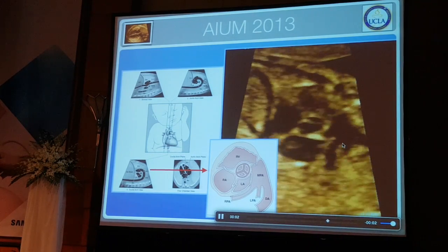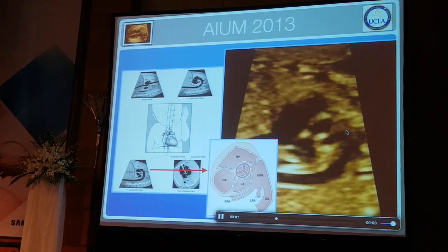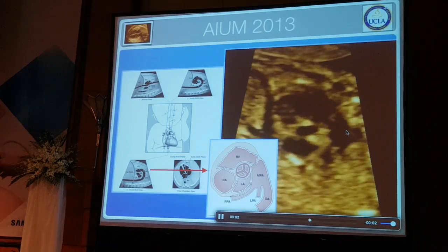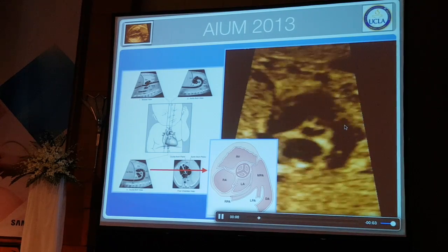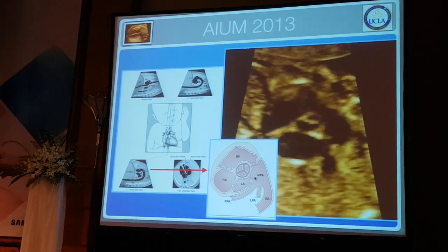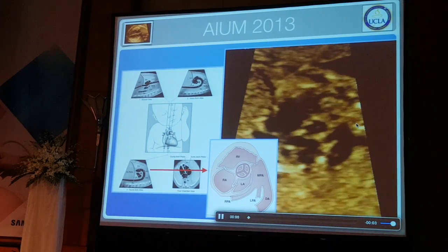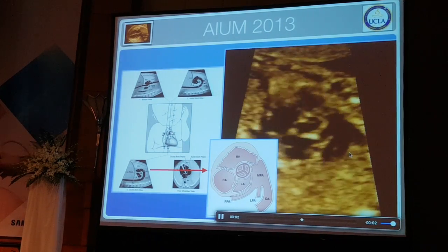This is one thing that isn't talked about a lot in the guidelines, but I think very important, is that the pulmonary artery should not bifurcate. Ideally, you want the pulmonary artery to trifurcate into the right pulmonary artery, the left pulmonary artery, and the ductus. In the diagram, there's the right, the left, and the ductus. So here, right, left, ductus.